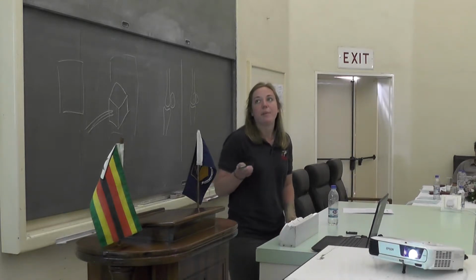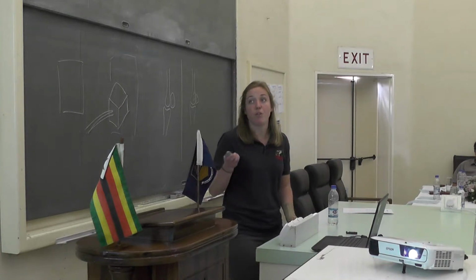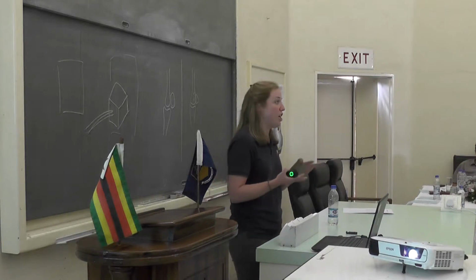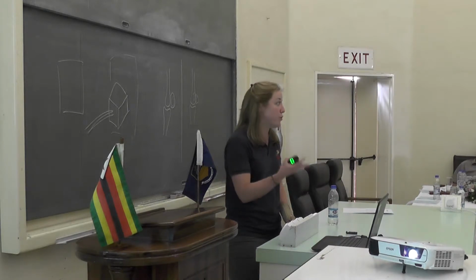And then again, think about the exposure of whatever you're going to image. And again, this is equipment specific, and for example, I certainly do not know these by heart. I don't see a reason why you should have to know these by memory. You can always consult the manual, but all you need to understand is the principles of how they are applied and what they change, like Ben said: adjusting the clarity of the structures with the kV and the mAs, the quantity of radiation going through per second, and then understanding what increasing or decreasing each of them will produce, and therefore you can adjust if you're not happy with your results.